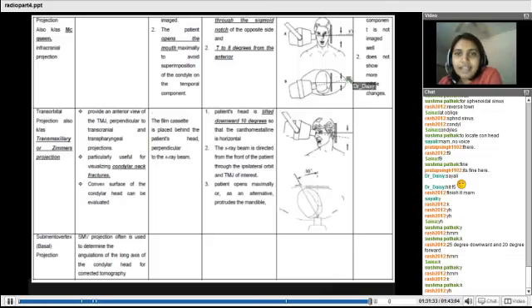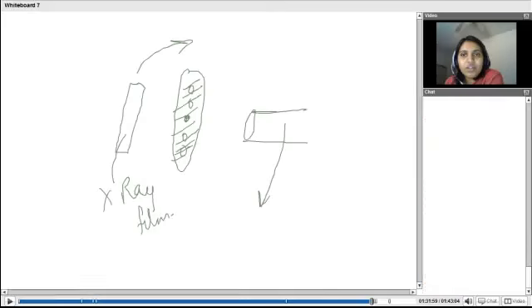Here in the diagram it says 10, the text says 7 to 8, so it's somewhere in the range of 10 degrees backwards. So it is 5 degrees upwards and 10 degrees backwards, and we are passing it through the sigmoid notch of the opposite side. So this side has the film, through the sigmoid notch. See, after opening the mouth you get the sigmoid notch palpable. Do you guys know what the sigmoid notch is?